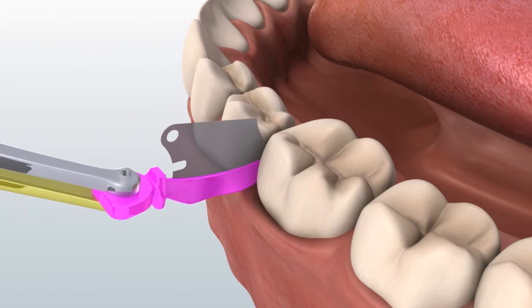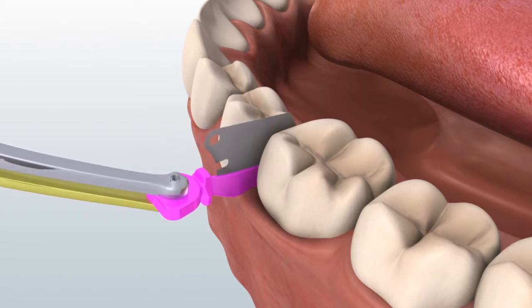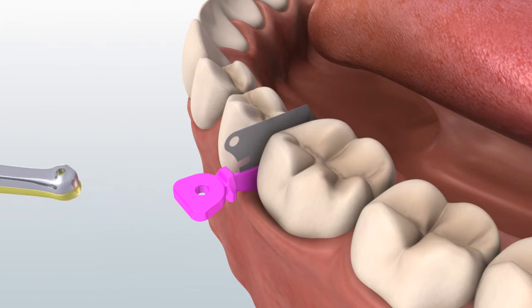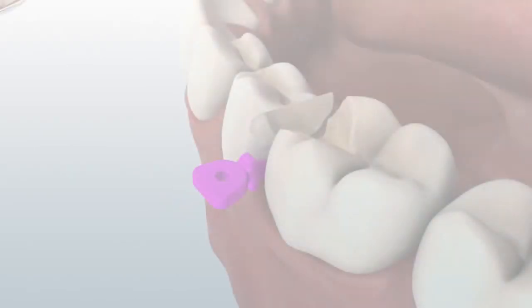Pre-wedging with a wedge guard protects the adjacent tooth and the gingival tissues, preventing tooth damage and gum trauma during cavity prep. The wings of the wedge guard will compress as they pass between the teeth, then expand again to fill the embrasure on the lingual side, with the central concavity of the wedge locking it in place.